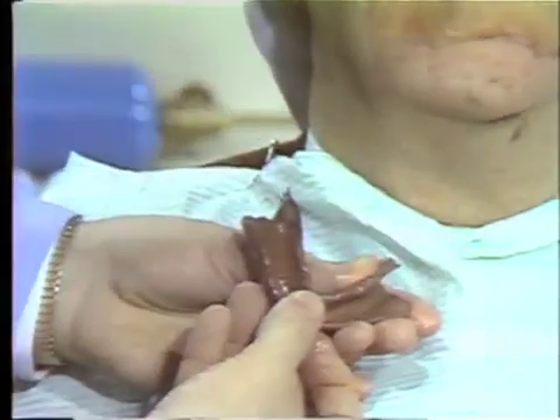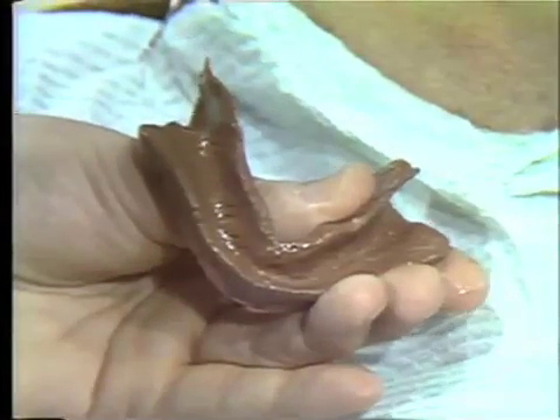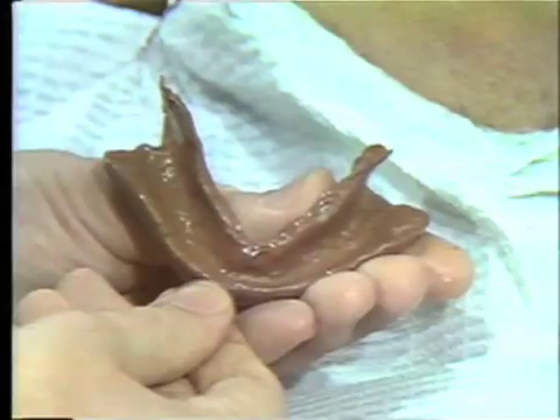After a 10-minute period from the start of mix through the polymerization of the light-body rubber base, we can then remove the impression tray from the patient's mouth. Just relax now — free that up and carefully remove it. At this point you should always first inspect the mouth to make sure there are no loose particles. None being present, you can then inspect the impression. You can see here that we have a very nice impression — we have recorded the roll on the buccal, the labial, and everything seems to be in order. At this point we would go to the laboratory and box the impression in preparation for pouring the master model.